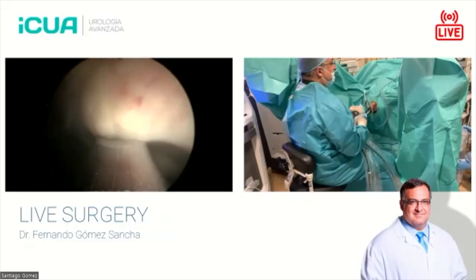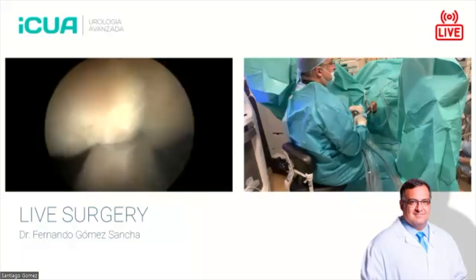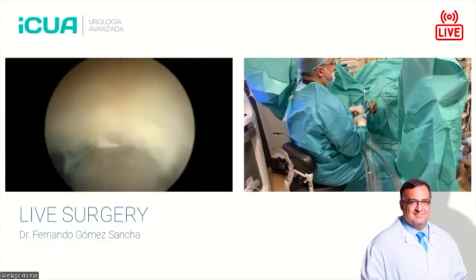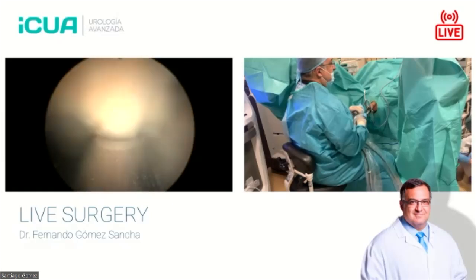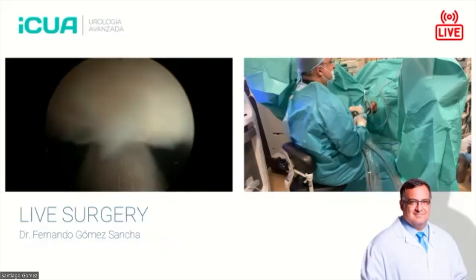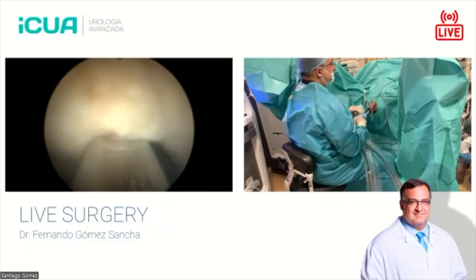Of course, if you have a fast morcellator like this Piranha morcellator, then you will progress very fast and the morcellation period will be very limited. We usually average 10 grams per minute of tissue. So typically for a 90 gram adenoma, it would take us 9 or 10 minutes to take the tissue out, which is much faster than the original morcellation speed, which could be double or triple that time.